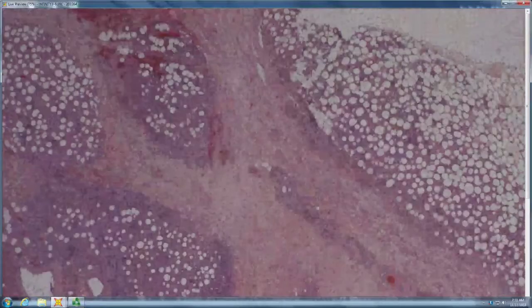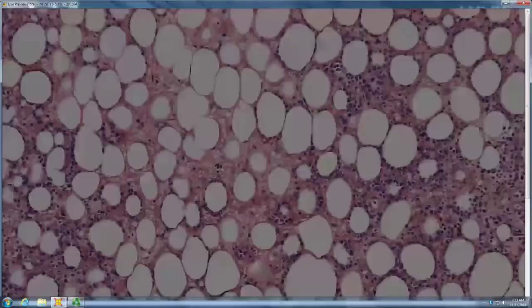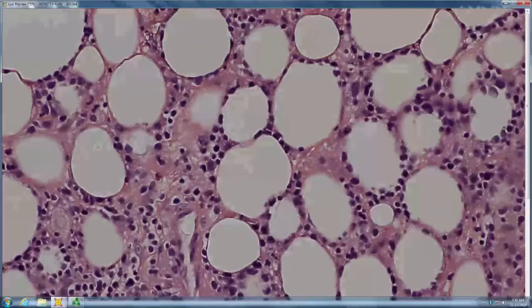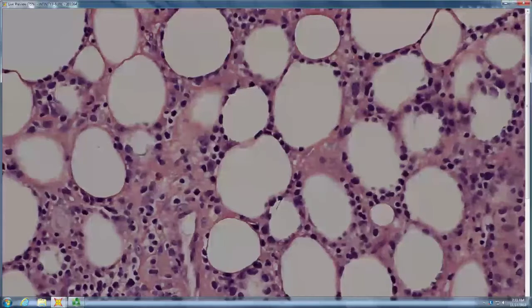Lobular panniculitis. And lobular panniculitis. Do you see any lymphs roaming around? And are those lymphs round, or are they kind of squared off? Yeah, definitely squared off. So hyperchromatic square lymphocytes. Does that sound like a nice benign lymphocyte? No, it's not bad enough, but yeah, exactly. So that's a subcutaneous panniculitis-like T-cell lymphoma.